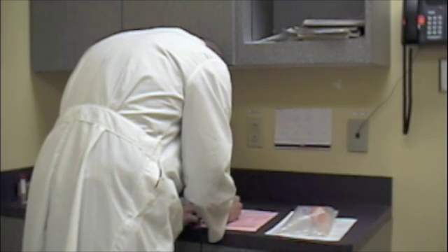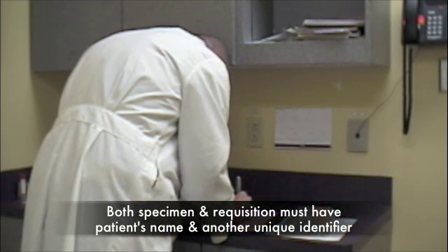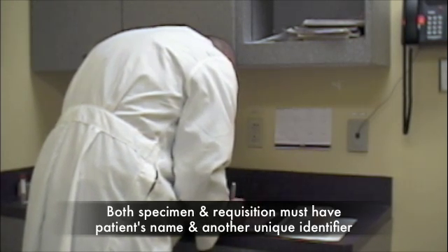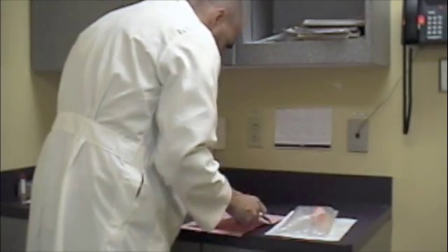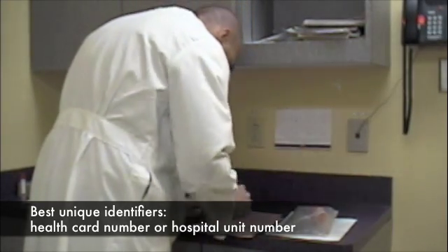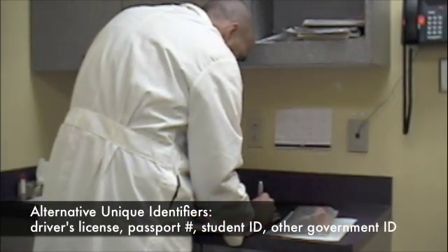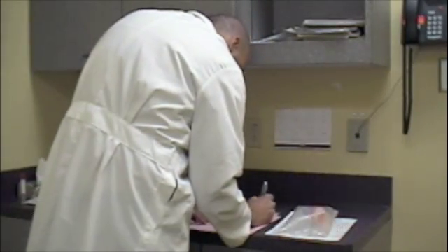It is critically important that both the specimen and requisition are clearly labeled with the patient's name and another unique identifier. Lab accreditation standards require that both are properly labeled and matched, or else the specimen cannot be processed. The ideal unique identifiers are the patient's health card number or hospital unit number. However, if these are not available, other potential identifiers can include driver's license number, passport number, student identification, or other government-issued ID.